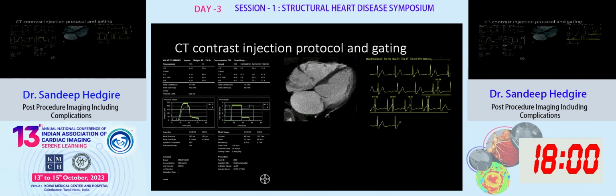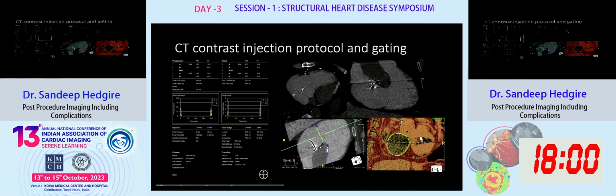I already mentioned contrast injection protocol in my earlier talk. So here is a little snapshot of how our injection protocols are phased into 3 different phases of injections: pure contrast, contrast-saline mix, followed by pure saline, as indicated before. The gating by default is retrospective for these kind of scans. Very rarely we get requests to give as little contrast as possible.